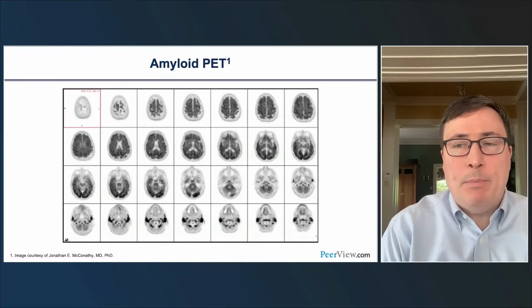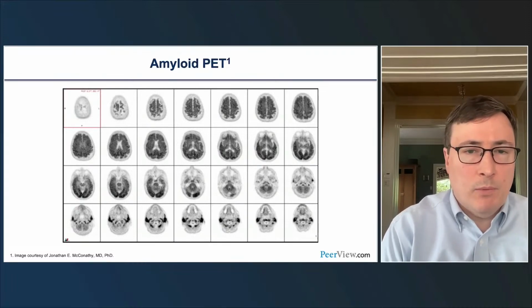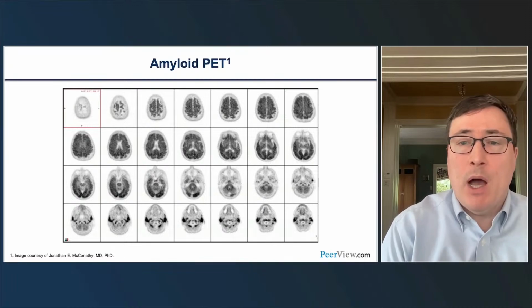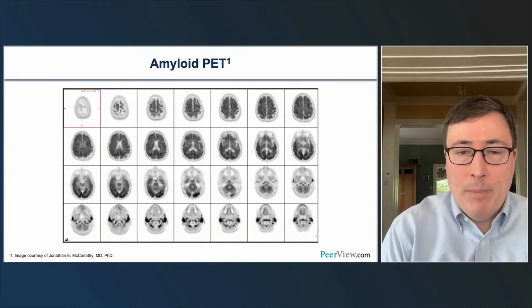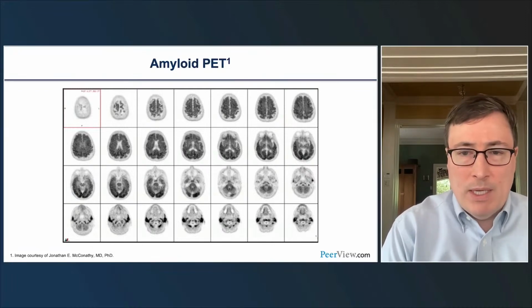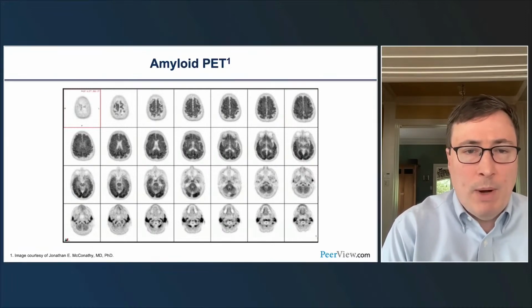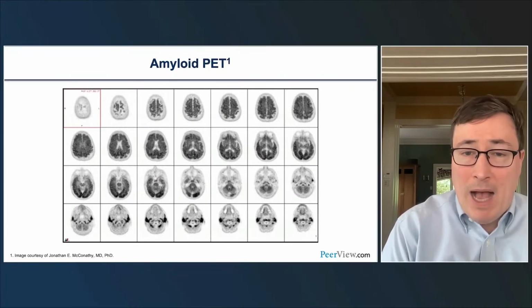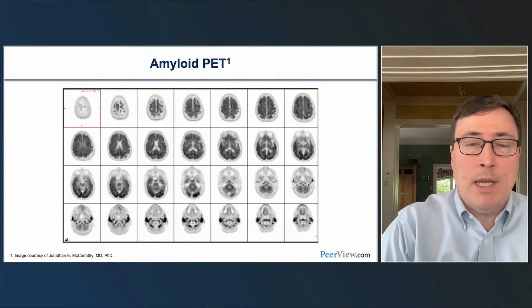So here's an example of using this sort of workflow in a real clinical case. This is a patient who presented with cognitive impairment and predominant language difficulties at presentation. So here's the results of their amyloid PET, and this is a straightforward case of a clearly positive amyloid PET scan with really loss of gray-white differentiation throughout the cerebral cortex. And in fact, in some areas, maybe even a little bit of higher activity in the cortex compared to white matter.